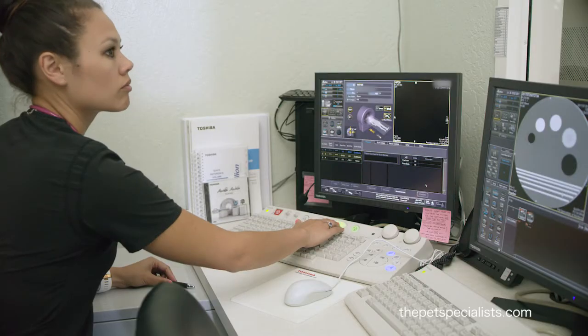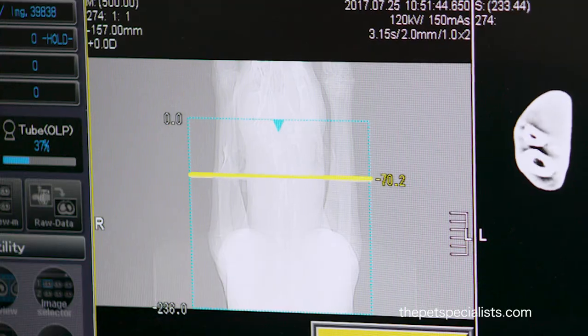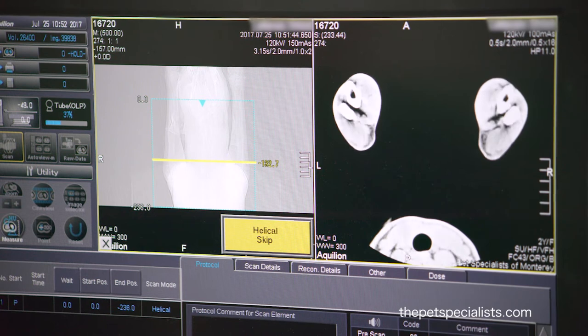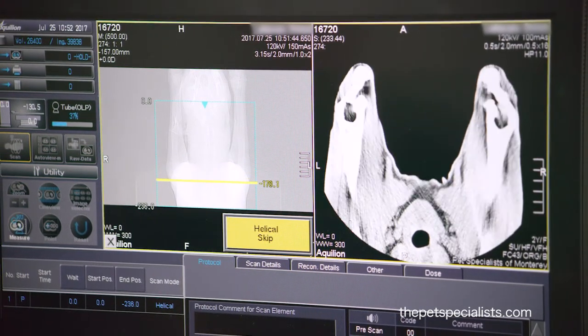For this dog, the entire elbows have been imaged in about six to eight seconds. Here are the images as the patient passes through — what you're seeing on the top are the bones of the radius and ulna coming in, getting to the elbow, and on the bottom is the dog's chest.